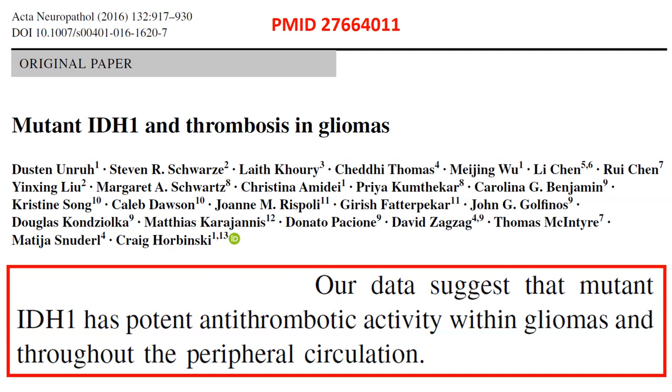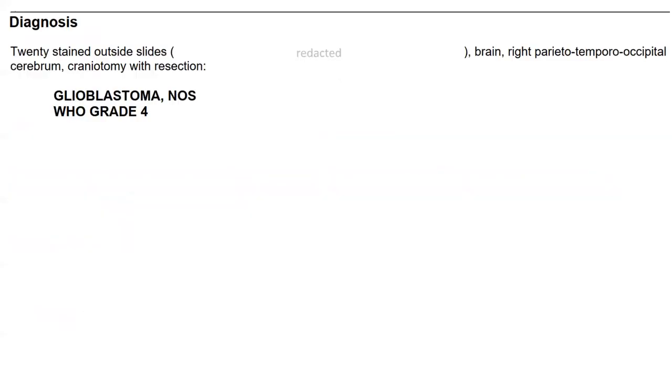I remember, it was probably about 28 years ago, Dr. Raymond Sawaya, a founding chair of the Department of Neurosurgery at MD Anderson Cancer Center, told me he knew it was going to be glioblastoma because of the thrombosed vessels right on the surface as they go in. And we see the same thing histologically in the IDH wild type glioblastomas. These microthrombi we also see. It's not 100%. It's not pathognomonic. It's supportive.